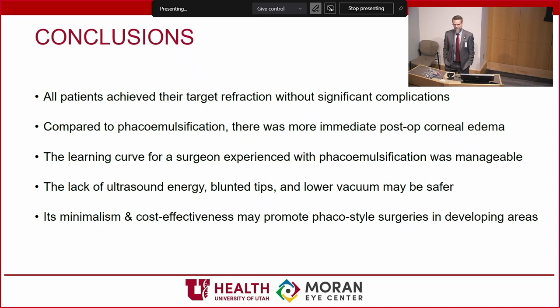Yeah. You will see by the patterns. The patterns will tell you very clearly whether you're getting these shell impact marks. Where you're getting that scattered debris, you'll get an area just nuked, and an area that's just nuked, and another one that's just nuked, and you can see the particle size by, bam, corneal endothelium where that thing whacked into the cornea is just gone.